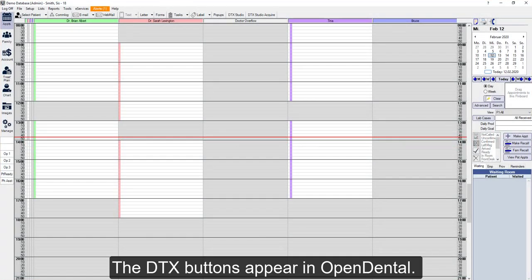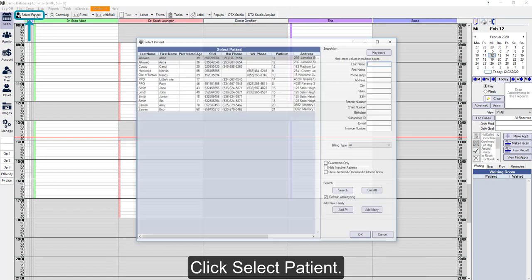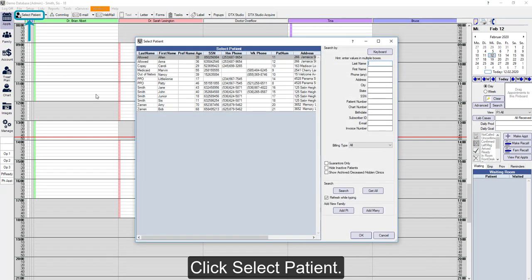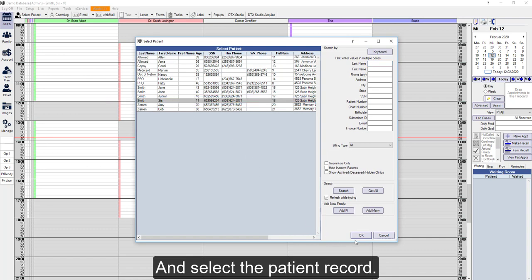If Open Dental is linked with Clinic, the DTX buttons will appear here. First we'll click Select Patient and then select the patient in Open Dental.